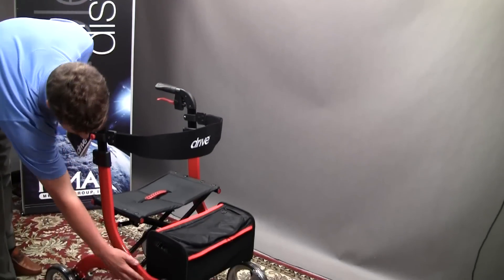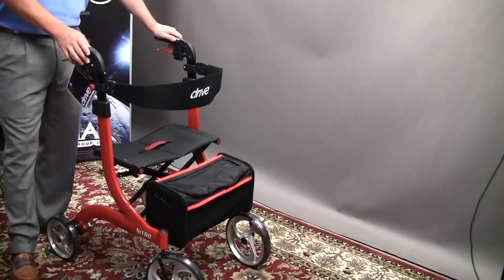Hi, I'm Kyle with Drive and I'm here to talk to you today about the Nitro Rollator. The Nitro is our highest end rollator and I'll show you a couple of reasons why. You get a good sense of the frame — it's what we call a sleek European design.